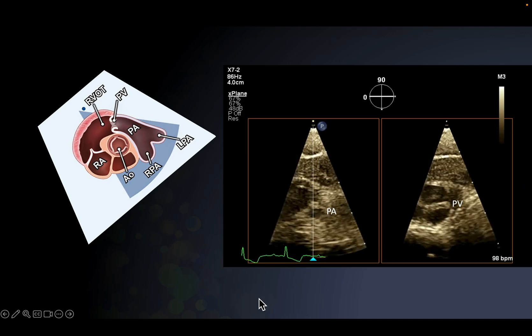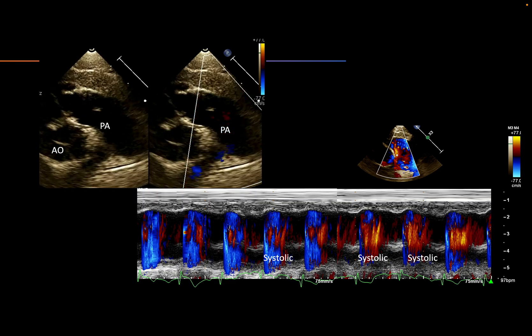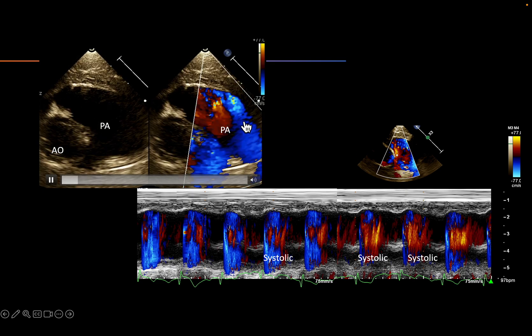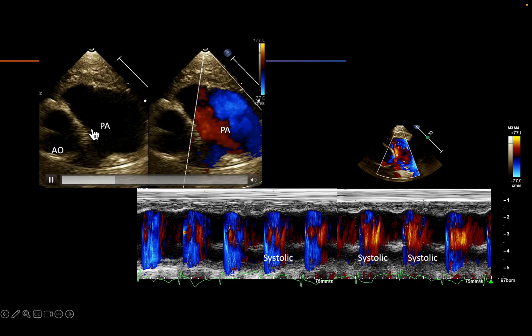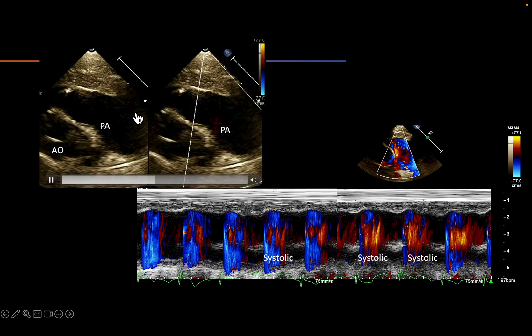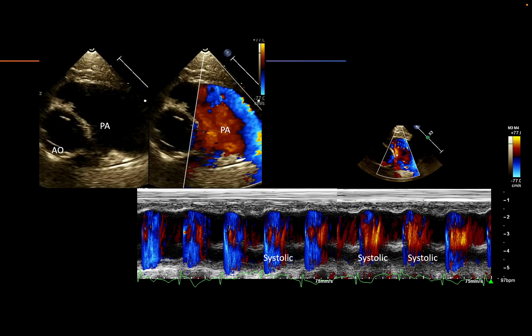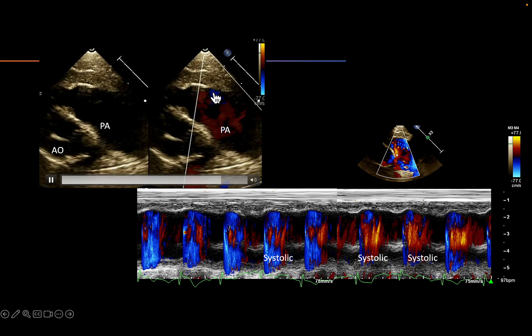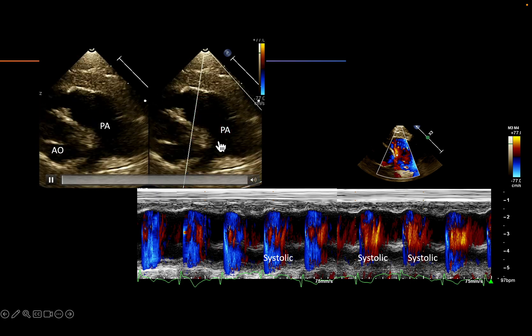Now I'm bringing in a new concept. Here you see a dilated pulmonary artery with an eccentric jet of the pulmonary valve, yet the pulmonary velocities were normal. Clinically or on echocardiogram I would have made the diagnosis of idiopathic pulmonary artery dilatation, because the flow is normal and the pulmonary valve is not stenotic. That's what I am left with - idiopathic dilatation of the pulmonary artery. Here you see flow coming towards the probe due to encircling of blood flow in the dilated pulmonary artery.